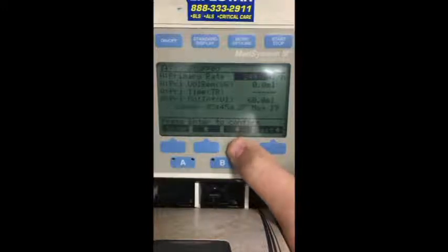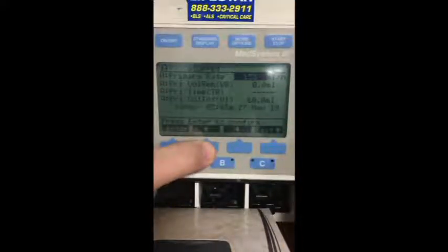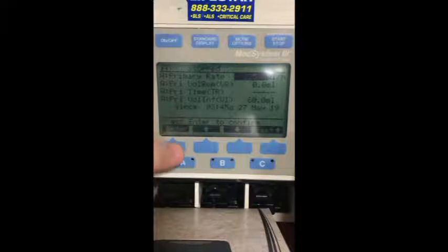225. Now I could go individually down, or I could hold it. And after it waits, it jumps by 10. So you get to 225, it'll jump here and go fast. And then I hit enter. If you don't input something in, it will alarm at you. And that is telling you that something needs to be selected.